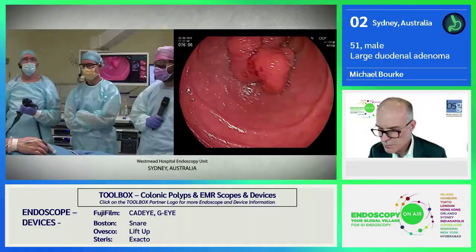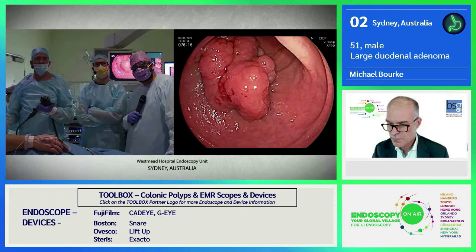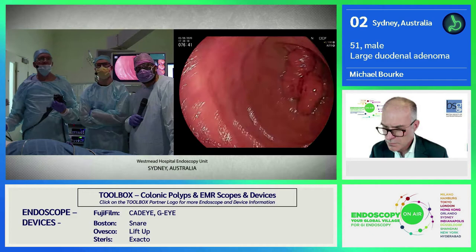This is a bulky duodenal polyp. So duodenal polyps, first thing, these patients have a 3 to 7-fold increased risk of colonic neoplasia, so they all need a colonoscopy. And then the other thing is to establish where the papilla is. The papilla we previously looked was up here, there it is, right?